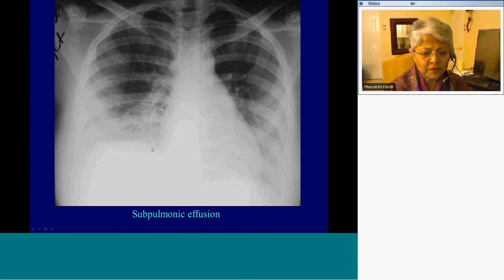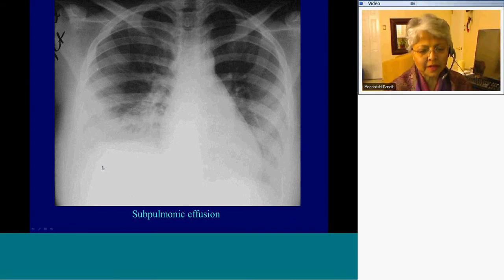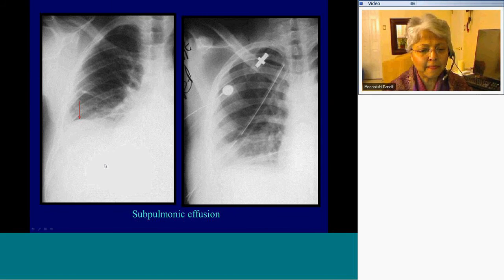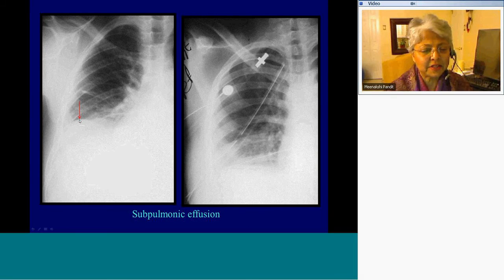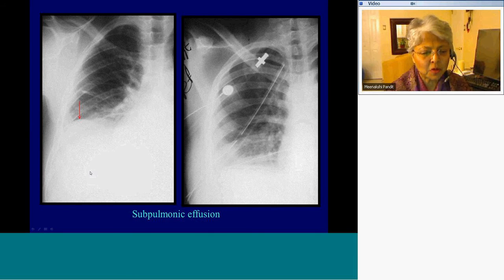Not obvious, but still somewhat lateralized — opacities at the right base caused by a pleural effusion. Separable, lateralized apex of the right hemidiaphragm, pleural fluid with chest tubes — subpulmonic pleural effusion.